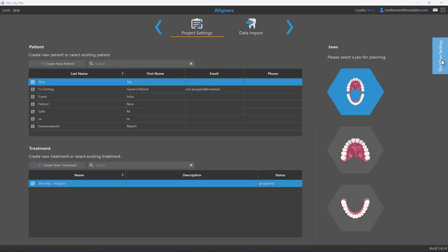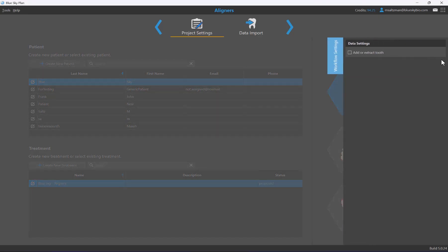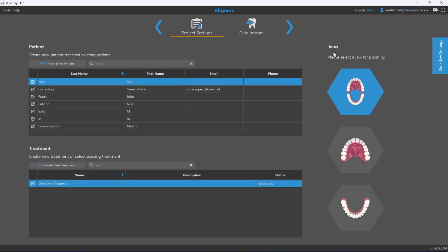For proceeding, we have workflow settings pertaining to the particular case and flow. For example, there's a checkbox for adding or extracting a tooth — the flow will change if you're adding or extracting during this aligner treatment. These settings affect the flow and automation built into the case. You can open and close workflow settings by clicking on them, and the settings are pertinent to the specific treatment type.